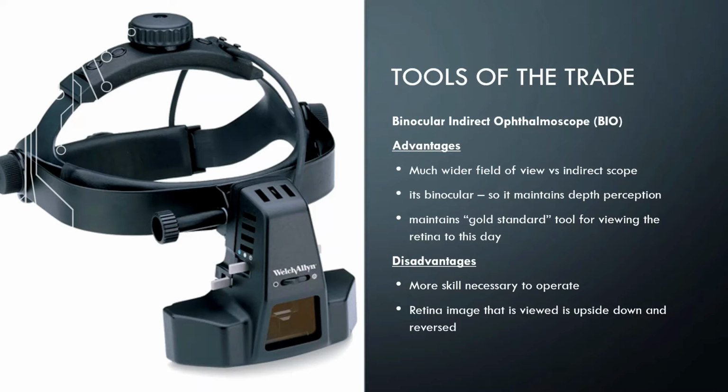Your retinal specialists, in particular, know these instruments inside and out, and they depend very heavily on the BIO to do their retinal exams because they want to have a live look. Now, the disadvantage is it takes a lot of skill to operate these. And we use them here too.